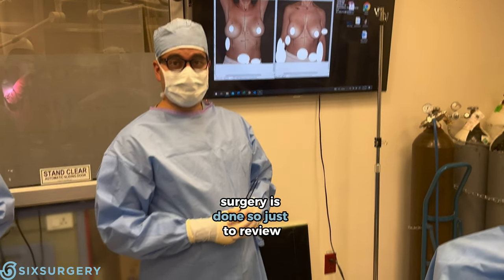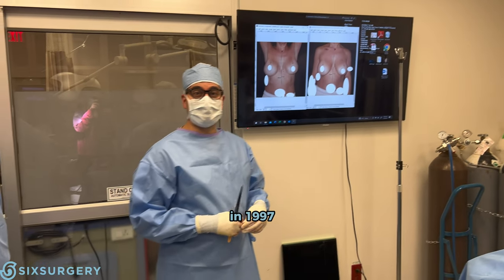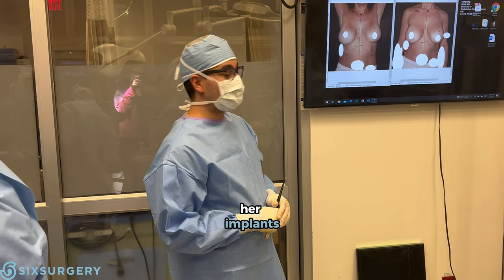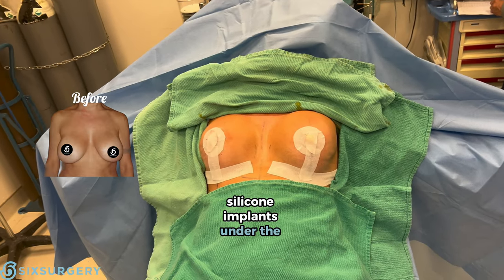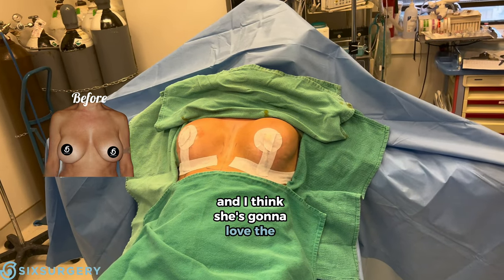Surgery is done. So just to review, this patient previously had a breast augmentation in 1997 and came to see me for a revision of her implants. She has new implants now — high profile silicone implants under the muscle with an anchor lift. I think she's much more even now and I think she's going to love the result.